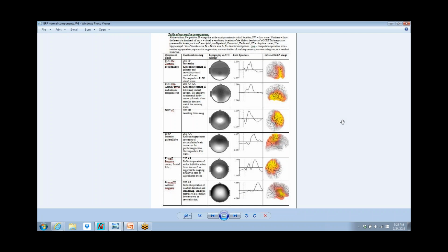I mean, it's mental math, but what age group? When was the last time your fourth grader did a quadratic equation? You can't give the math task to an adult that you would give to a kid, and you can't give the kid's task to an adult and expect it to actually task them with the same kind of load. So the tasks that are out there, reading, mental math, that sort of thing, are very poorly constrained tasks. They do generally bring out rhythmic abnormalities, but they're not necessarily a well-constrained task.